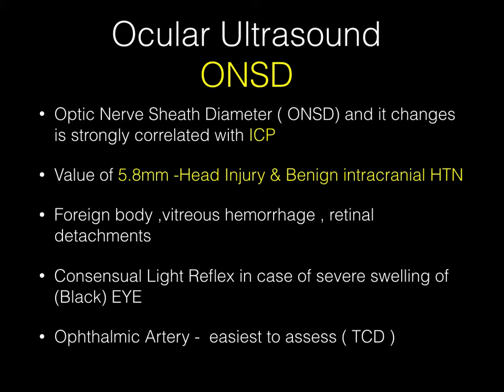Ultrasound can capture the same finding without the expensive cost of MRI. We can see the optic nerve and optic nerve sheath. A value of 5.8 mm or more has been linked to increased intracranial hypertension in adults. So if somebody's optic nerve sheath diameter is more than 5.8 mm in the correct clinical context, you are on the right path.